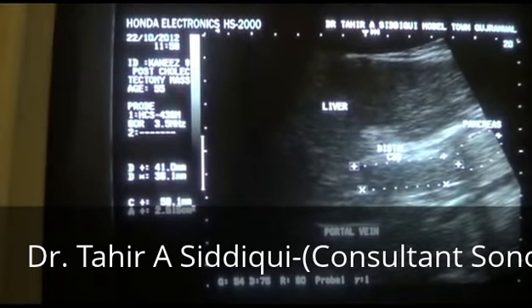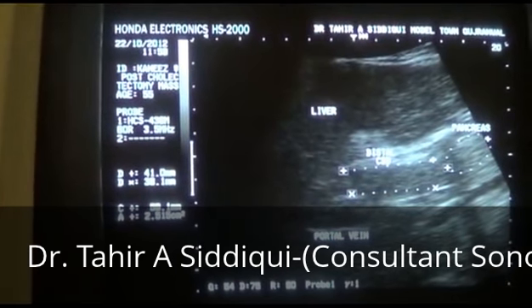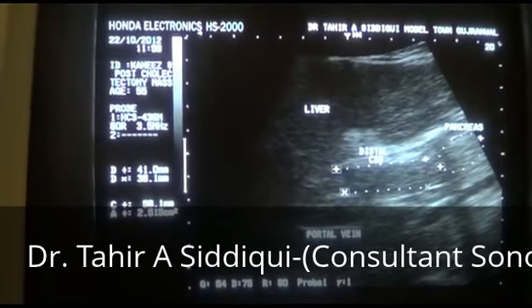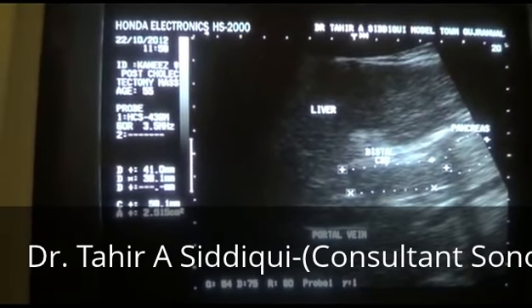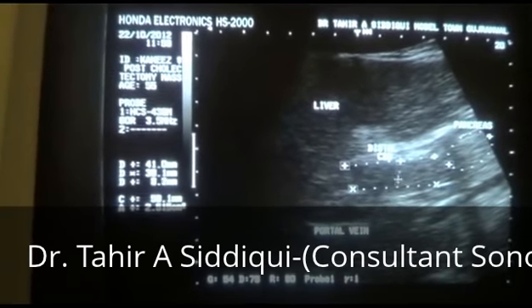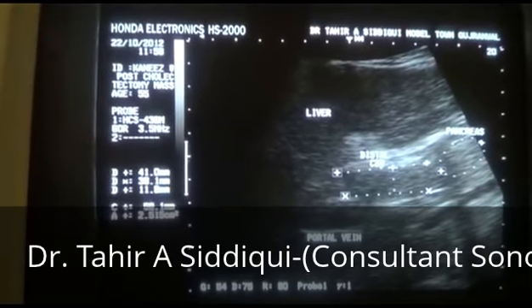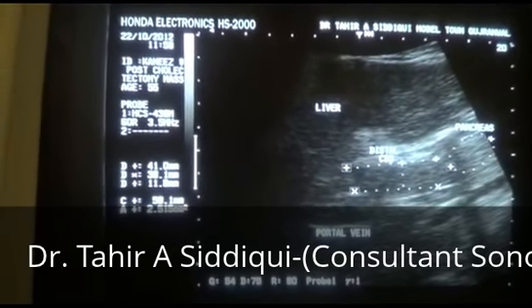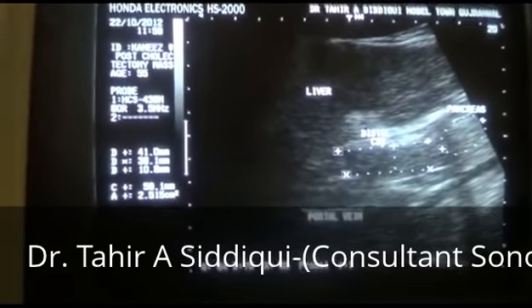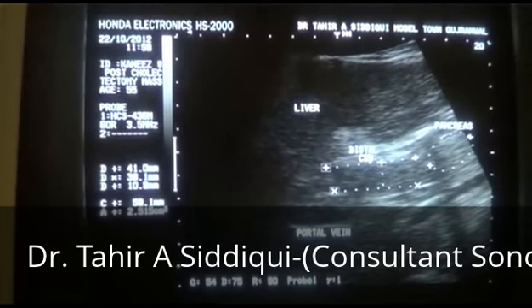So in this patient we see two pathologies. One, subcutaneous collections in the region of the hypochondrium extending posteriorly, consistent with abscesses, or simply, if you wish, it would be better to say collections with dense coarse echogenic material within it.